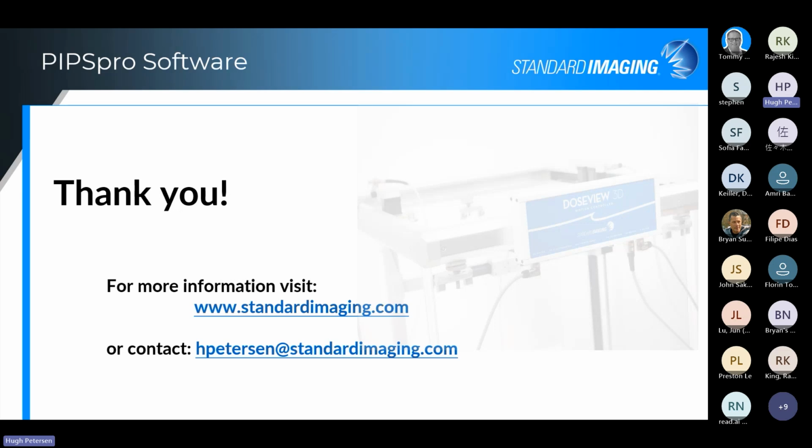Looks like I've got a couple of questions that were brought up, so let me take a peek at those. One is, do we have any tests for tomotherapy? Not specifically. We are looking into adding some of the imaging components for tomotherapy, but we work very closely with Accuray on a lot of other products, and this is something we're looking to do.